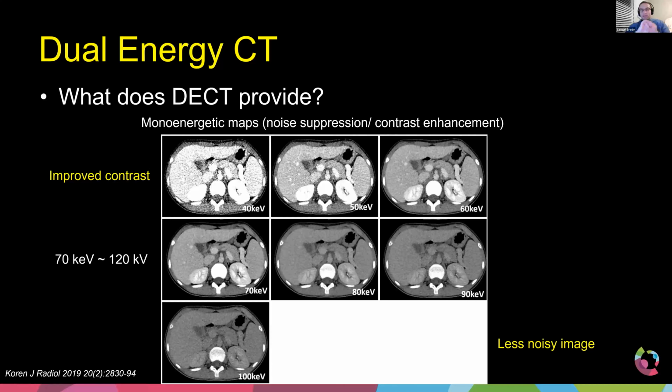And so this is one of the benefits where, in my opinion, identification of uric and non-uric in pediatrics is really not that big of a deal. And hopefully we're not really dealing with gout with kids. Some may have arthritis issues, but for the most part, those tend to be usages or protocols that we would create for adults. And so oftentimes as a pediatric physicist, everyone asks me, well, what do you use dual energy for in kids?